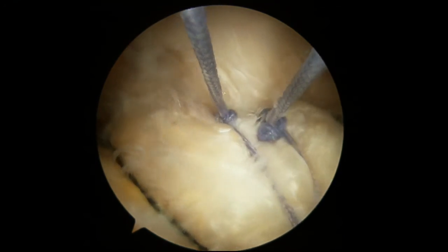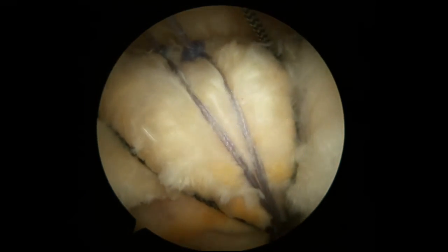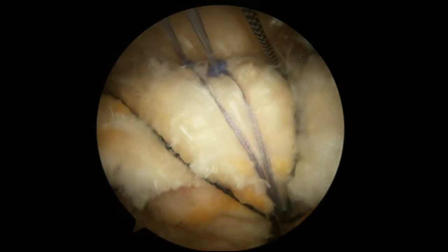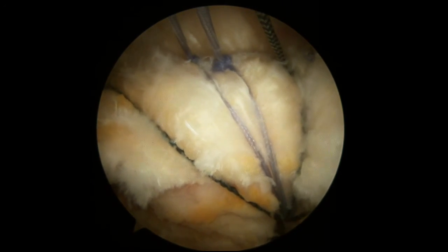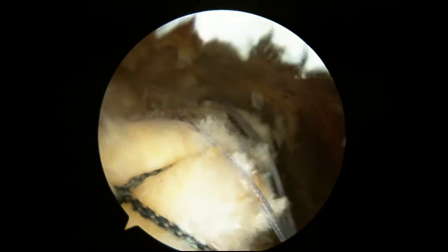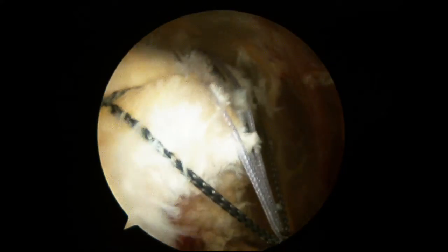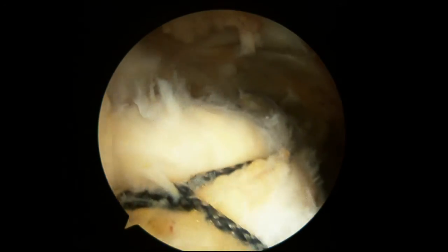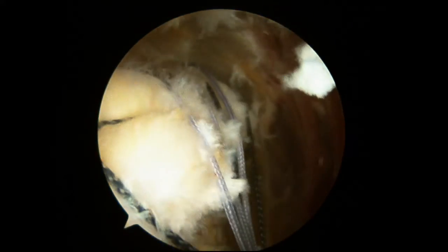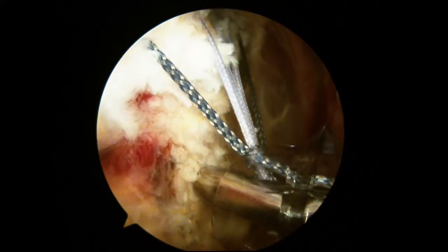In order to fix that lateral edge, we put in that second row anchor. Here you can see the first one, and you can see how the tendon is already flattened down. We've taken one suture from each of those sutures. Getting ready to place the second lateral row anchor, we're taking one limb from each of the tied-down sutures and putting that on the second anchor laterally. You can see how the tendon is already flattened down very nicely.